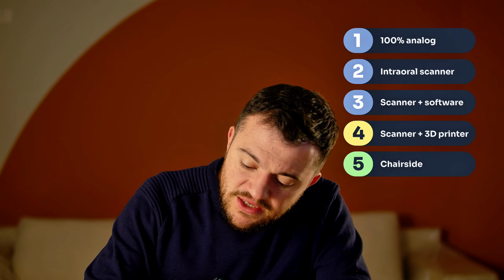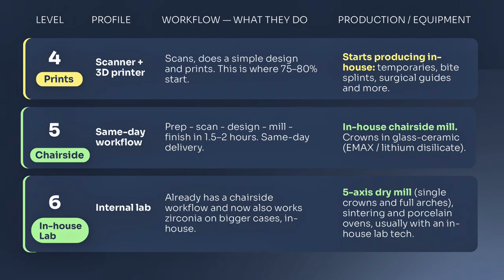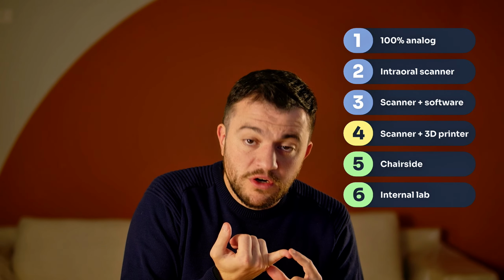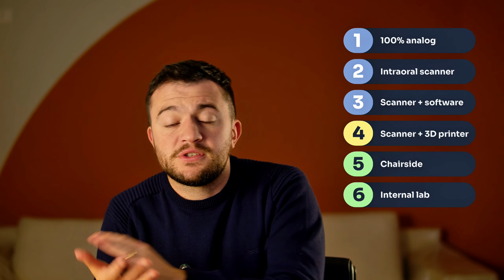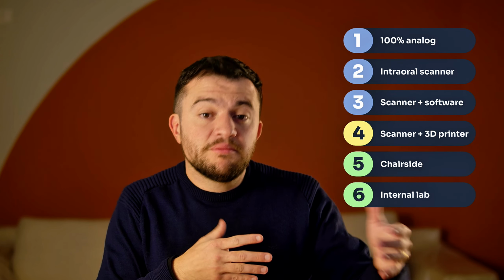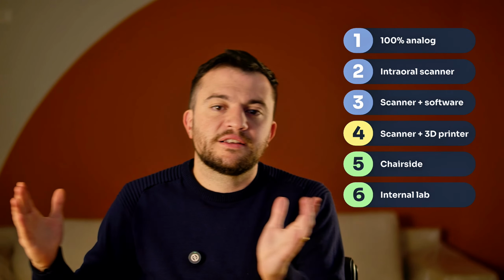And number 6 is also a growing level, which are the doctors that have in-house labs. There are different levels to having an in-house lab, but here I'm focusing on the doctor that already has some sort of chairside workflow and now is also working with zirconia on bigger cases in-house. So they probably have a 5-axis dry mill that is capable of doing both single crowns and full arches. They have a sintering oven, they have a porcelain oven, and usually a doctor that has this kind of workflow has a lab tech in-house to do all that.